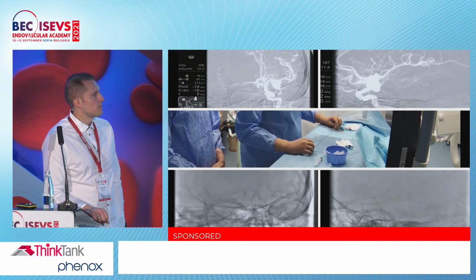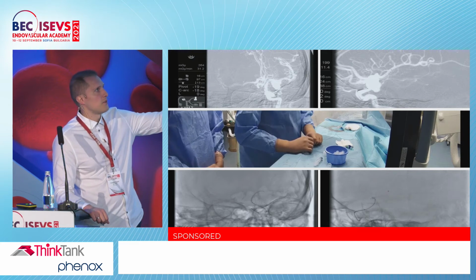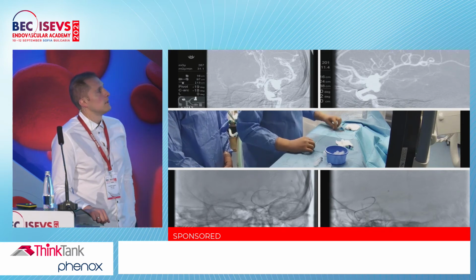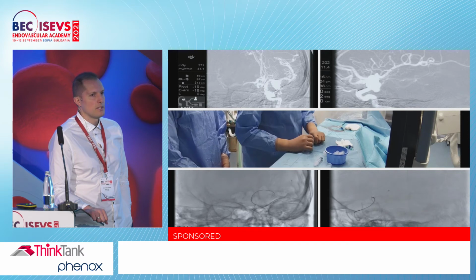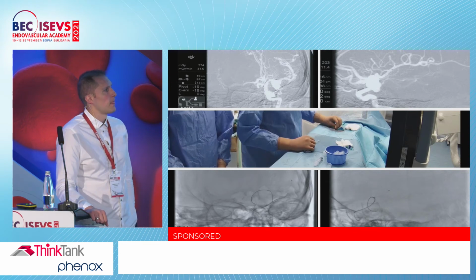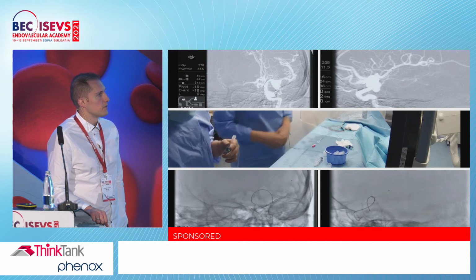So here is coming the second microcatheter, I think, for the coiling. We didn't use a distal access catheter. It's a young boy, so we used a 6 French Chaperone, I think, here in the petrosal segment. If I remember correctly, we most likely used the Echelon microcatheter for the coiling, and here is the Headway XT27 for delivering the flow diverter stent. So we are going with the wire inside the aneurysm sac, and just leave it here for the coils.